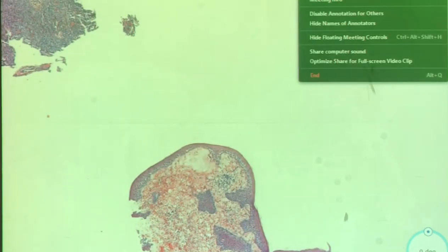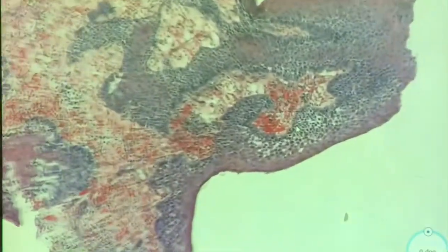Can you go up top, since I don't have a mouse, and where it says more on the right and it's orange? So that we can see, because people are in the chat, so click on chat, please. Even from afar, yes, even from afar it's something bad. And yes, invasive adeno. Yes. Love it. Okay, so invasive squamous. Invasive squamous.